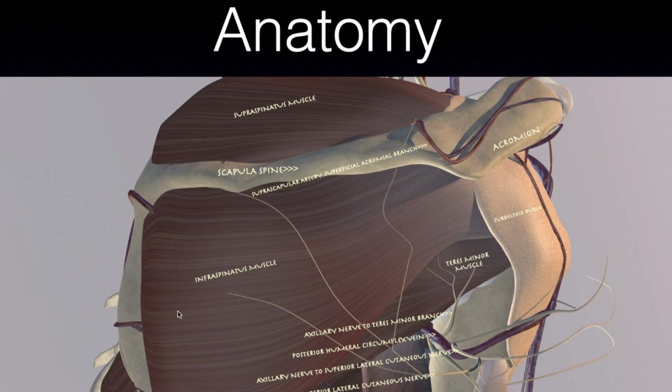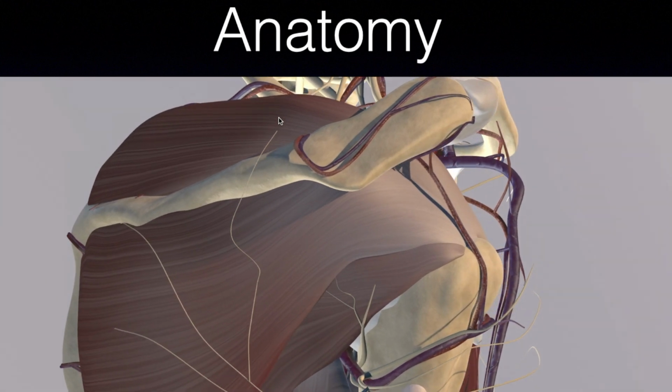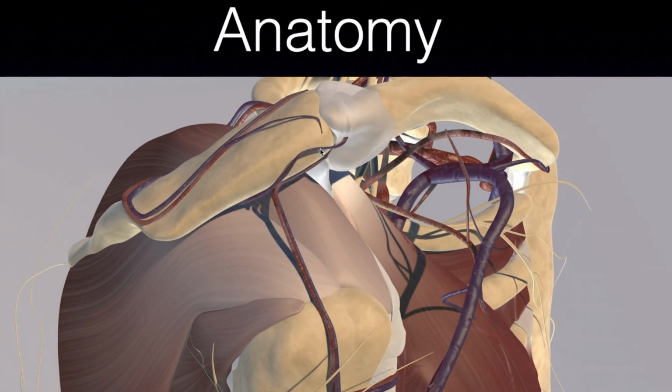And bone landmarks, like Dr. Jacobson mentioned, are probably your best way to figure out where you are. So if you're in the back of the shoulder, a very easy bony landmark is the scapular spine. If you have your probe essentially in a sagittal view, you know everything below that is infraspinatus and everything above that is supraspinatus. Here we're rotating laterally.